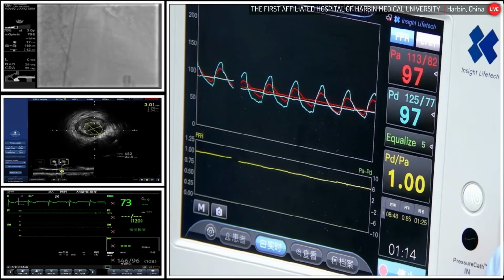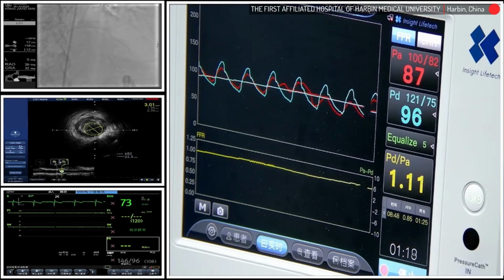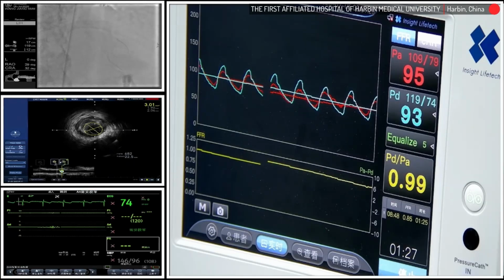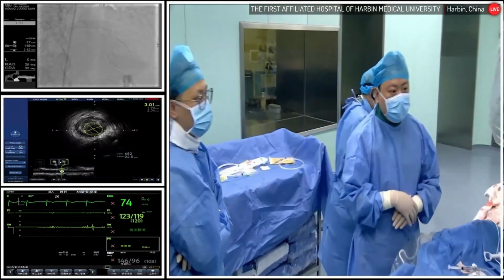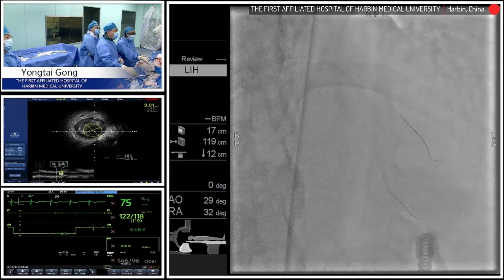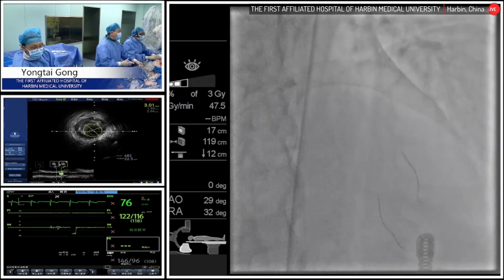Yes, almost 1.0. Okay, I think that there is no drift. Almost 1.0. Very good. There is no drift. The value is 0.85. Let me check again for the 0.85.